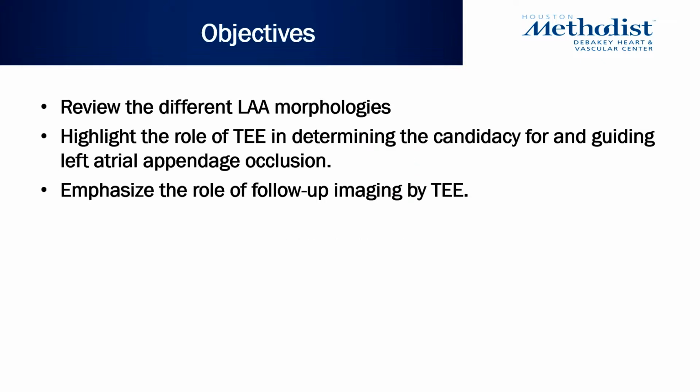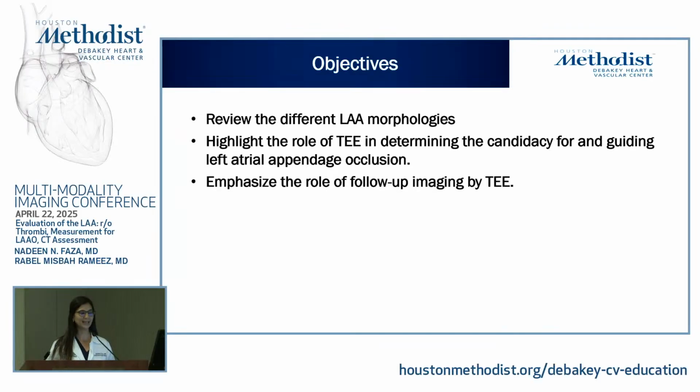All right. So we're going to review the different left atrial appendage morphologies, highlight the role of TEE in determining the candidacy for and guiding left atrial appendage occlusion, and emphasize the role of follow-up imaging by TEE.